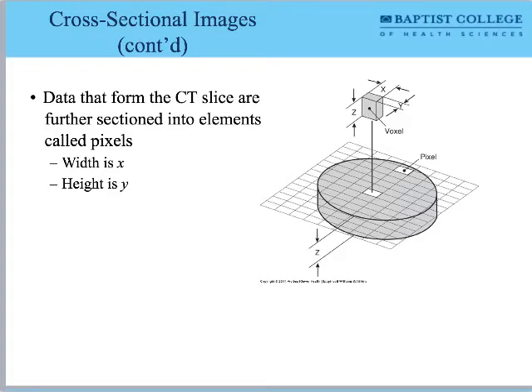Now, a matrix is just a fancy word for something that has X and Y values. I think about it as being like a chest of drawers, a big chest of drawers. So each one of these squares in this matrix is a drawer, and I can put things in that drawer. The computer's storing different things in that drawer. The stuff that it's storing in that drawer is information about each piece of the slice of bread. It's carving the slice of bread into little tiny dots, and it's sticking those little dots into different drawers.